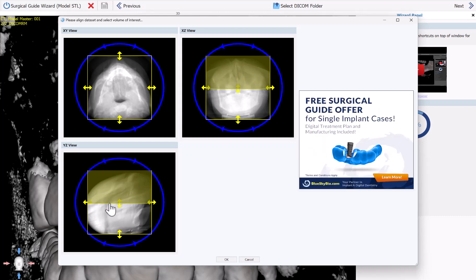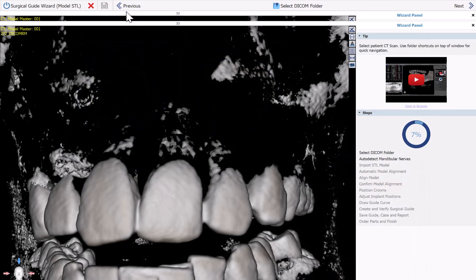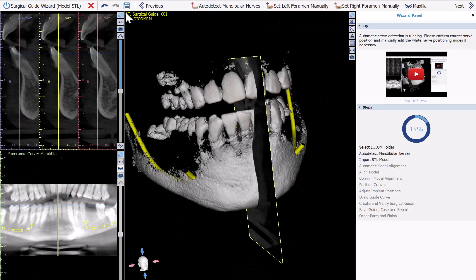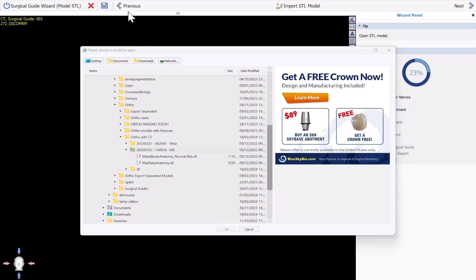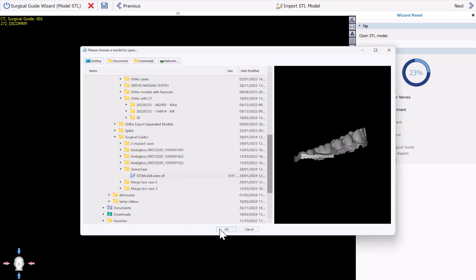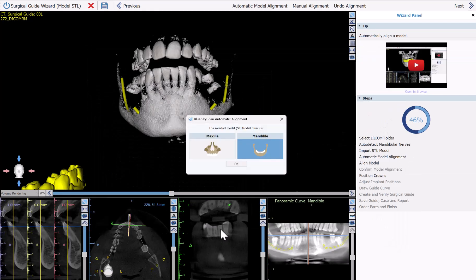I'm navigating my computer to locate the DICOMs. I'll use my left mouse button to grab and drag to find the relevant field of view. Our CT scan shows up on the screen, the nerves are automatically detected, we confirm that everything looks okay and click Next. Now I'm going to navigate to the STL model for this case — here it is — and click OK.